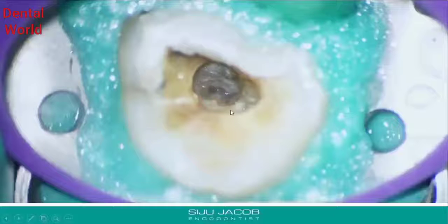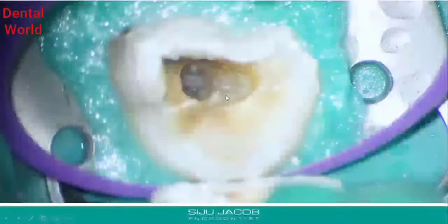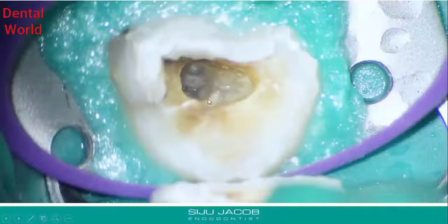Now, what do we do in a situation like this? We first evaluate: what is the cavity that the previous dentist has made there, and what about the rest of the tooth structure? You can see the cavity is in the middle. When you look at this palatally, there seems to be some calcified tissue here, and there's quite a lot of tooth structure between this part and the external palatal surface. So if you drill around this area, it's quite safe. That's what we see on the palatal aspect.